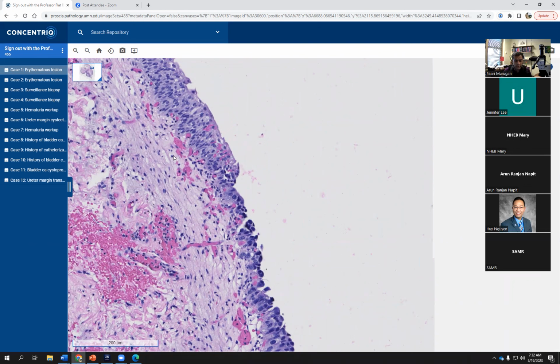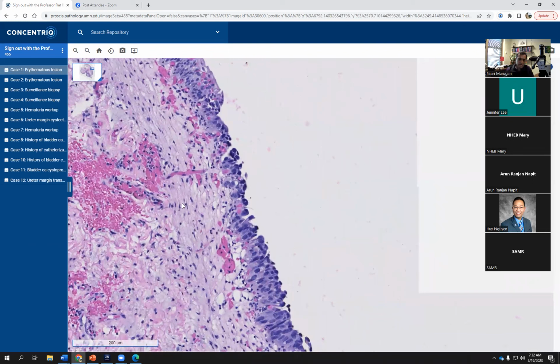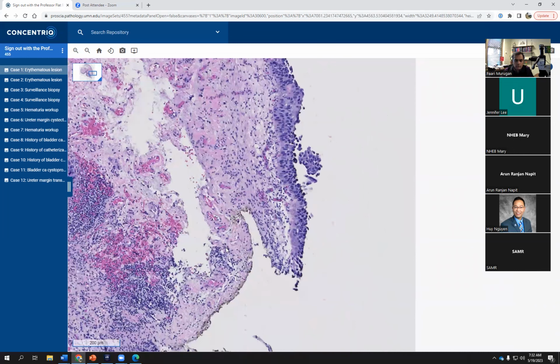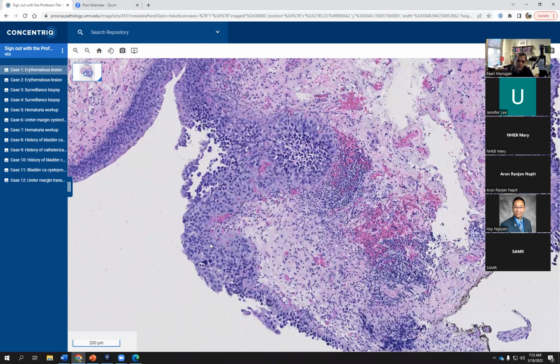It's always useful when you have a comparison of the normal urothelium, as I said, but in some cases, you may not have the normal urothelium, so you will have to depend upon the other morphologic features that I just described, right? So we keep scrolling along and everywhere it's a flat lesion, so it's easy to call this carcinoma in situ. But oftentimes, as you well know, we come across cases in which it's not completely flat. It is slightly thickened, and you might see, for example, an area over here, it is slightly thickened, and one could potentially visualize some early papillary formations in this area, right?